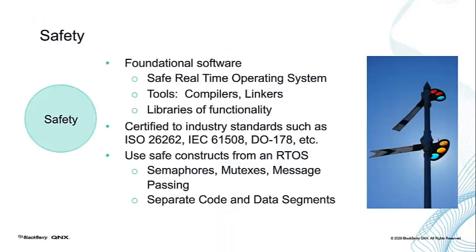Now let's dive into safety. The first is the foundational software. This would be your real-time operating system, and you choose one that's safe. That includes the tools that you'll use, anything that touches the code that runs on the target: your compilers, your linkers, any code generators, and libraries of functionality.